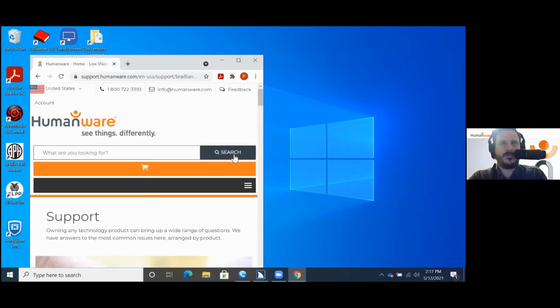And this is where we find all relevant information on the BI X Series. Again, video tutorials, lots more will be coming in that regard. Audio tutorials are here from our friends at Mystic Access, who do a wonderful job. Chris and Kim Nova. I think it's the first time I'm saying that on the webinar. No more Chris and Kim with different last names. So we have a marriage and a whole new name and a whole new way to look forward.